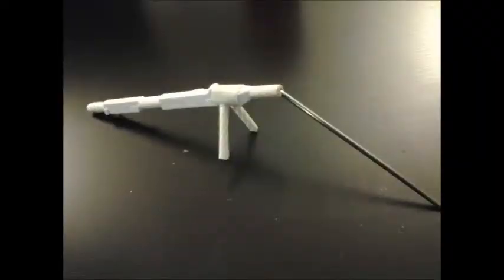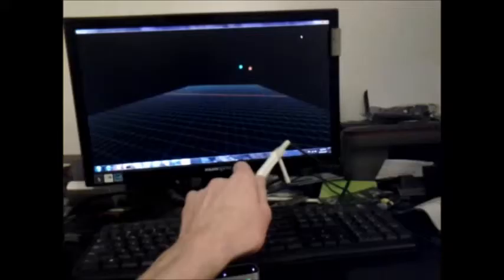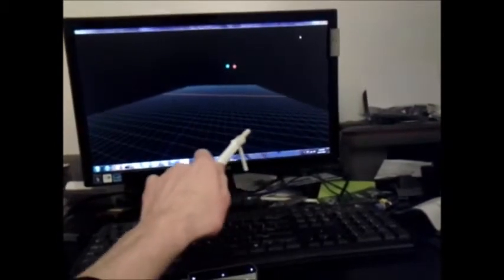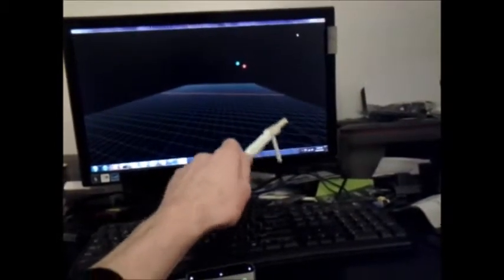The next 2 methods find the position and direction of 2 attachments to the tool. This method makes the distinction between left and right using the location of the palm of the hand. Right is shown in red, left in blue.